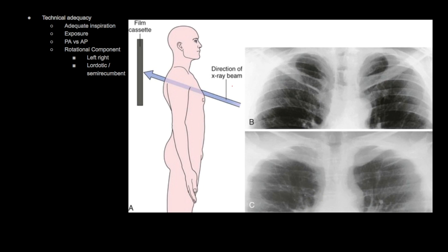Additionally, the direction of the x-ray beam is also important. This would be an example of a lordotic or semi-recumbent view — you see that the medial aspects of the clavicles are now projecting at or above the first posterior ribs, which is not ideal unless you're specifically trying to look at the lung apices. But on a regular PA film, we want the direction of the x-ray beam directed directly at the patient in a posterior-anterior fashion, and therefore the clavicles will line up around the third posterior ribs.